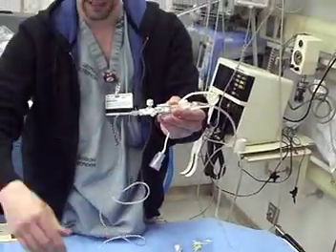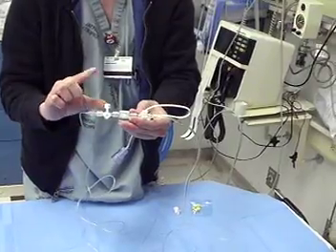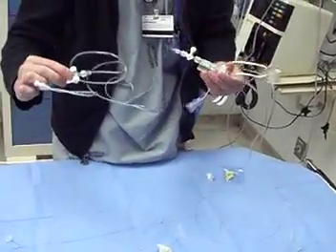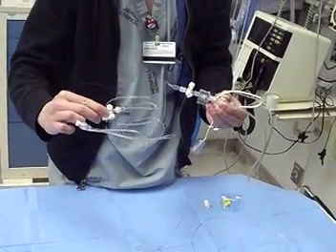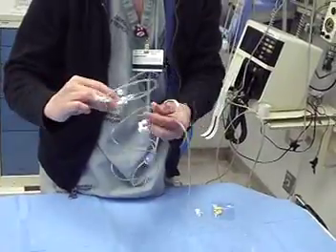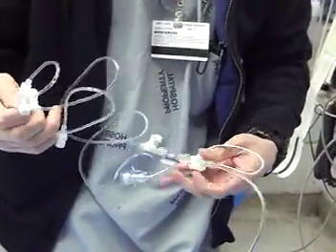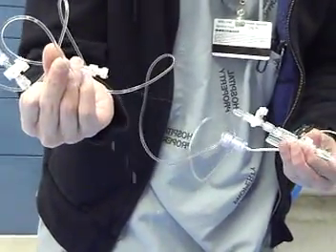Now we want to get the air out of the rest of the line. We're going to turn this stopcock to face the other direction — that portion's now off — and now it'll let the fluid flow down to the next stopcock. Squeeze the white tab again and look to make sure the air bubbles are out. Turn the stopcock towards the top, and now there's just a little bit of line left with some air in it. Squeeze until it comes out, and now there's no more air in the line.